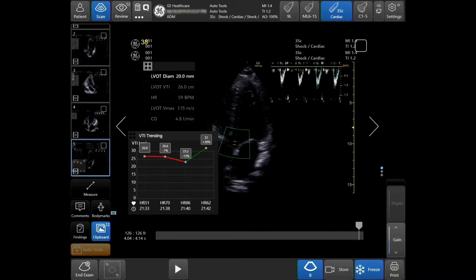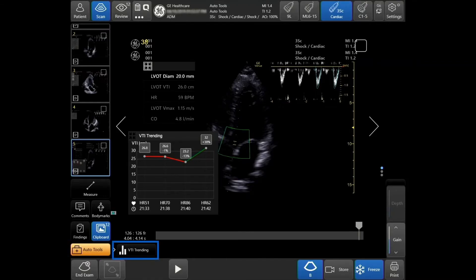VTI trending is a tool that will allow you to quickly visualize and trend over the course of time, and it will help determine the next course of action and treatment. To activate VTI trending, tap on your Auto tools in the bottom left-hand side of the touch screen, and tap VTI trending. You will see this option while scanning live. Here an example is displayed.